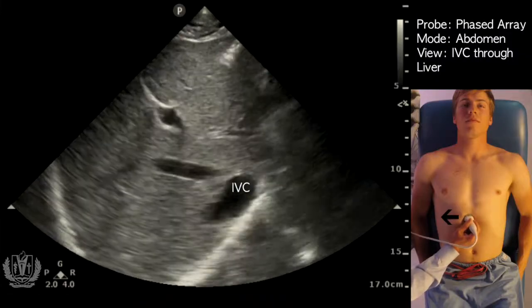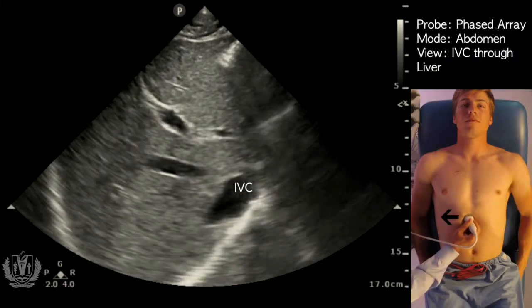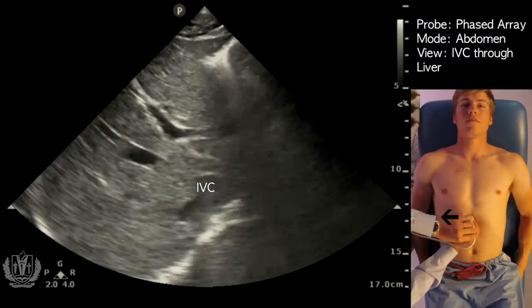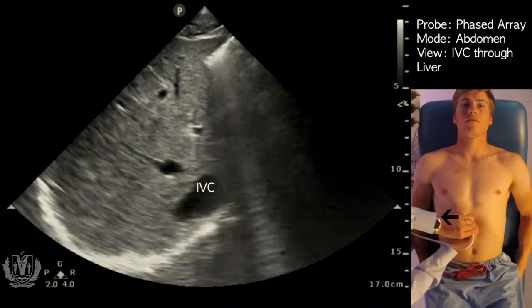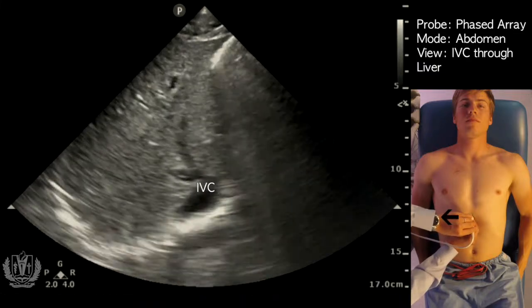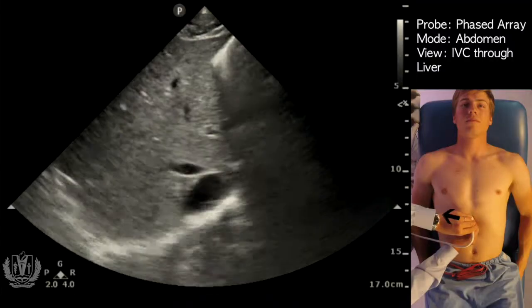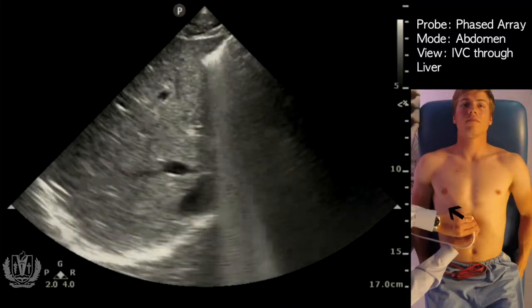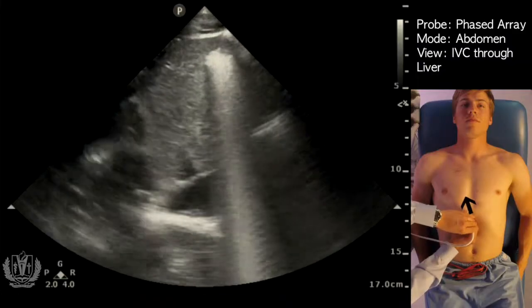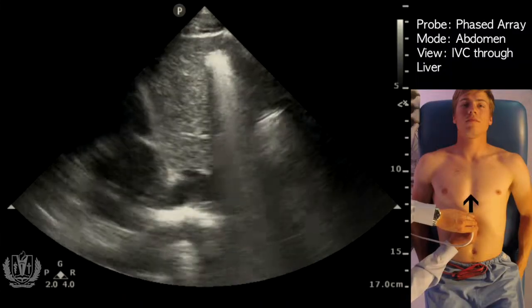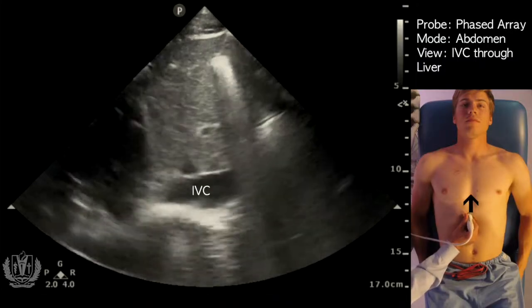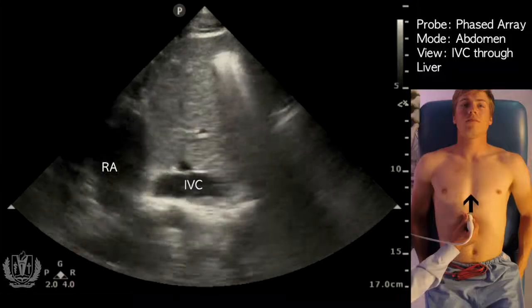Once you identify the IVC, use your right hand to center the probe to find it, then use your left hand to rotate. You cannot rotate the probe unless your vessel is centered — if your vessel is truly centered and you rotate your probe, you'll get the long axis view of that vessel. Here's the IVC.